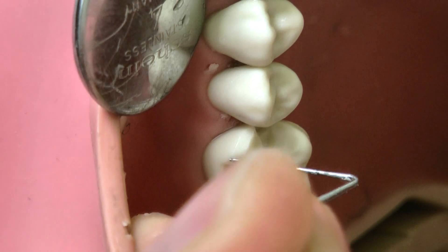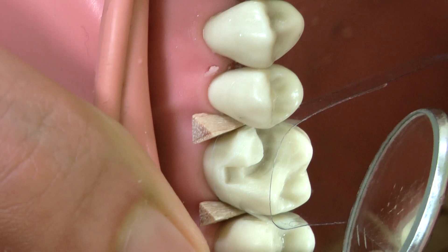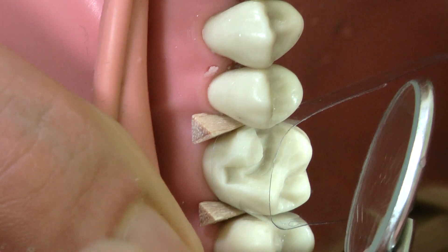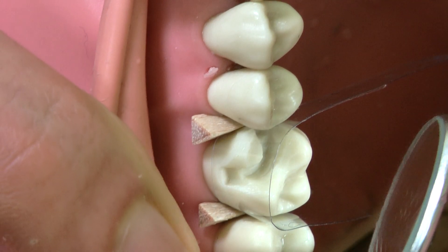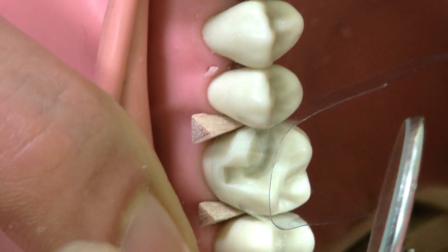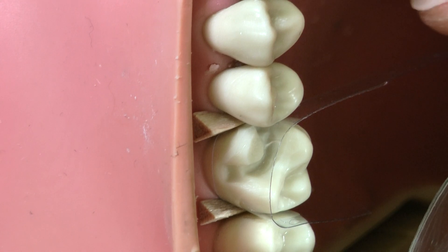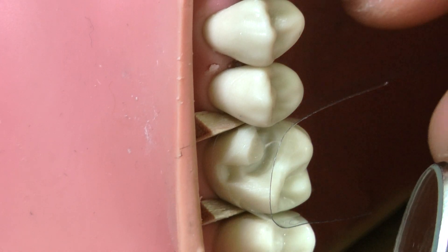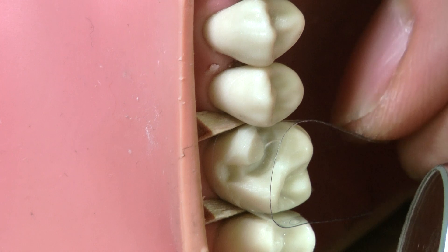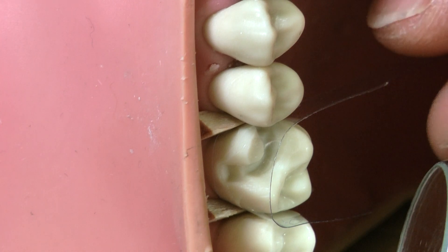Now we're ready to start building up with composite. You can see how I place the mylar strip around the tooth — I wrapped it around the buccal side with two wedges on either side to hold the mylar strip in place. I left the mesial side a little longer, because every time before I cure it I need to hold and wrap it around, so it's good to leave it a bit long so you can nicely grab it.